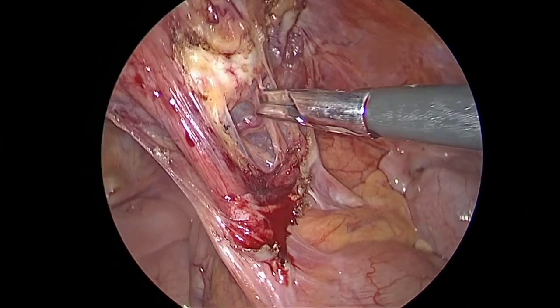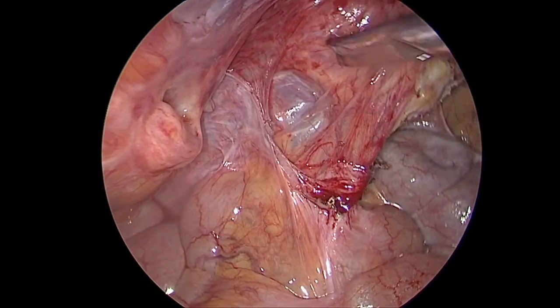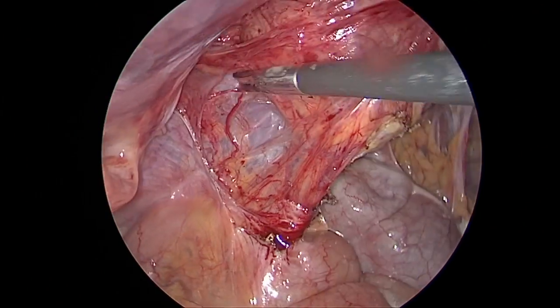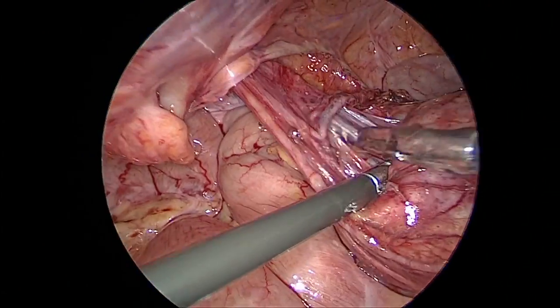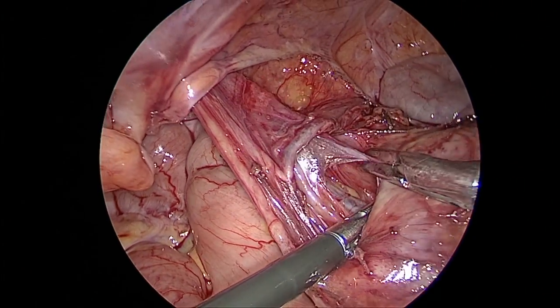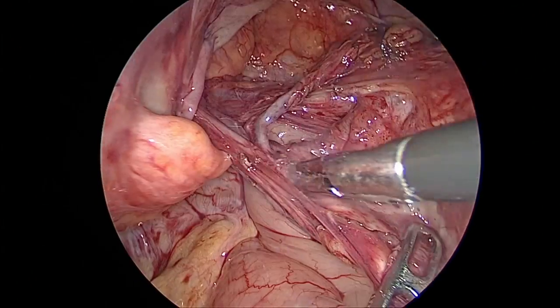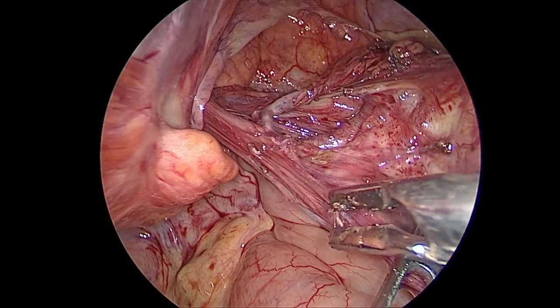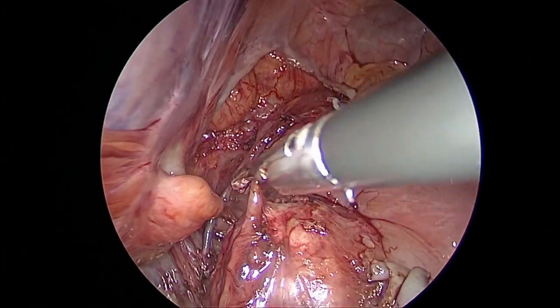So having done most of the dissection with the hook, I then proceeded to using a bipolar so that the feeding lymphatics could be well cauterized on either side, making sure that there is no lymphatic leak in the postoperative period, causing a lymphorrhea in this area. So you can see the enlarged lymphatics here.